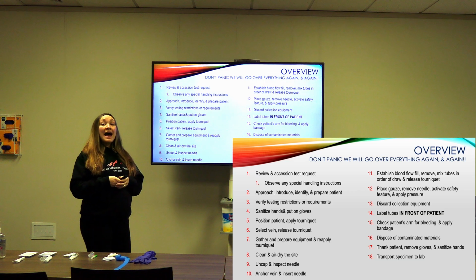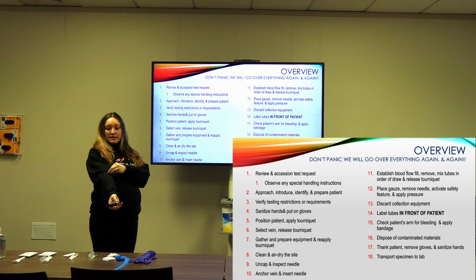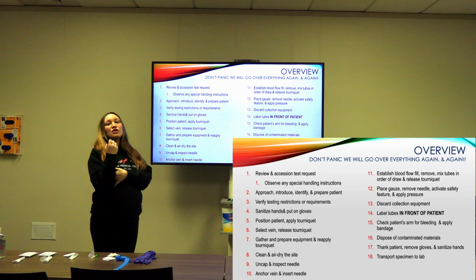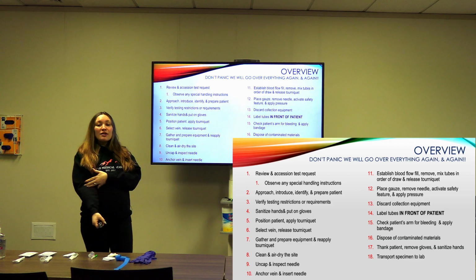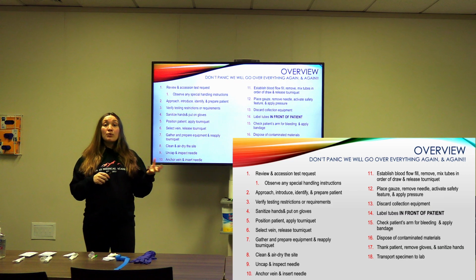In this step, you can ask the patient to take over pressure. So if I had a venipuncture and someone placed a gauze, they would say, okay, can you hold this for a moment? You can ask your patient to do that. They can hold pressure while you clean up your trash, take away your caps, label your samples.